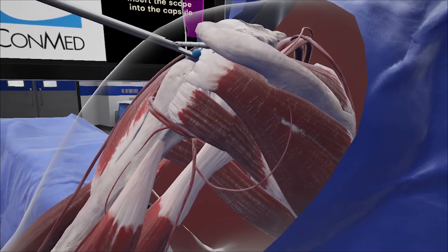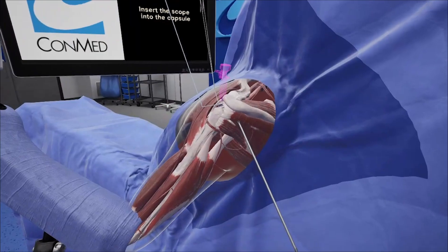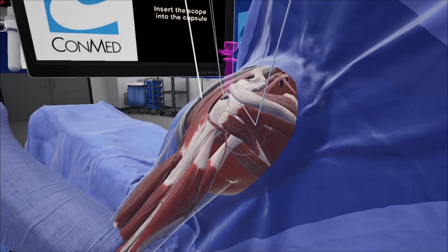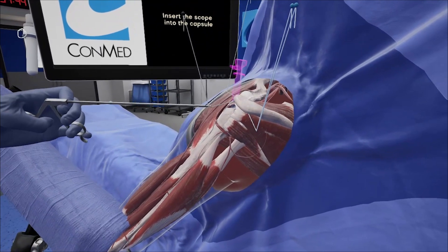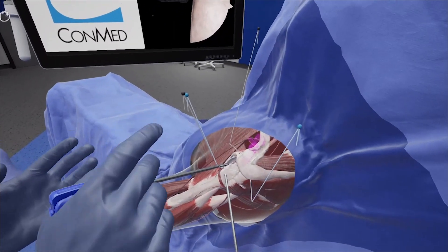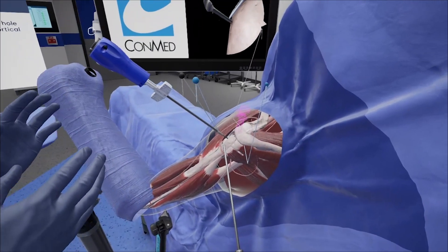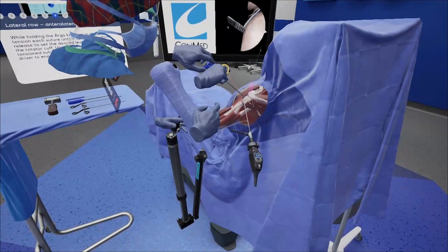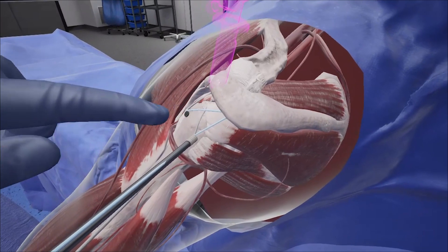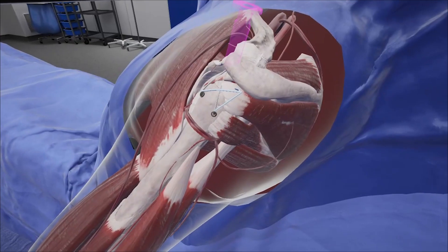I think you got it. Did I get it? Yeah. Perfect. So I want to set that down. I'm going to go grab this and it comes through that posterior portal. Perfect. Nice. I'm going to pull that out. I'm going to go back in here. I'm going to grab another lens. Now what we're going to do is go in there and find that position that I really like to put that down. I think there's really good bone. We're going to put that in. Now we've got to the power — I'm going to grab my mallet. There we go. That's a really nice looking repair. I'm going to give you guys an A minus on this. I think there's always room for improvement, but I'm definitely thinking you guys did an outstanding job here. That is exactly what we're looking for. Thank you.